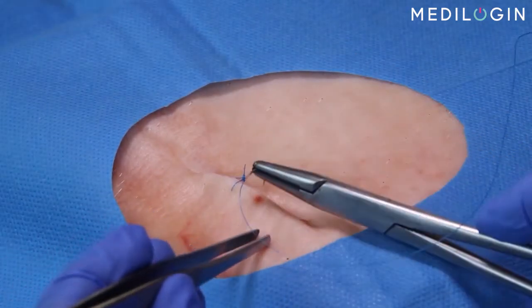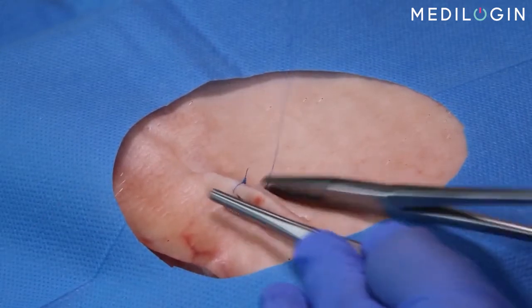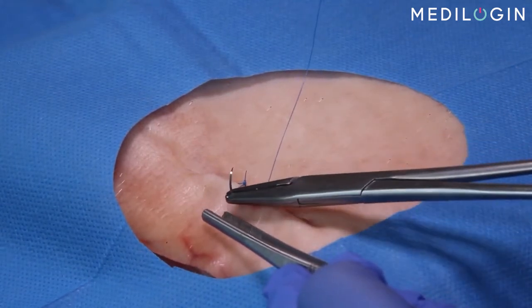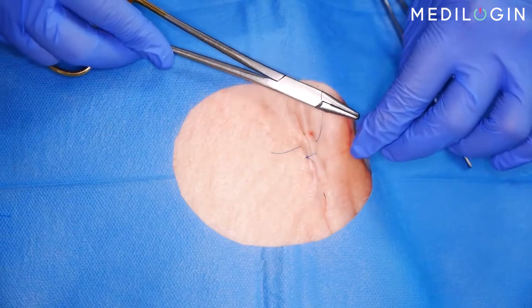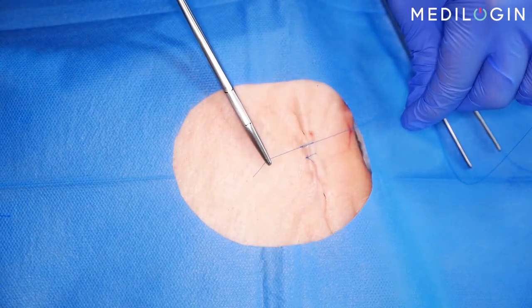Now the second simple interrupted suture follows. Make sure not to grasp the needle at the tip, but further back at the shaft. Advance the suture through the suture channel so far that approximately 2 centimeters remain on the beginning side. The suture is then knotted using the needle holder. Pull the suture perpendicularly to the wound and position the knot not on but next to the wound.